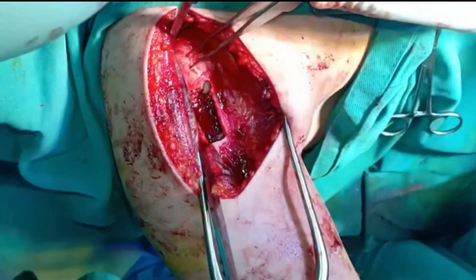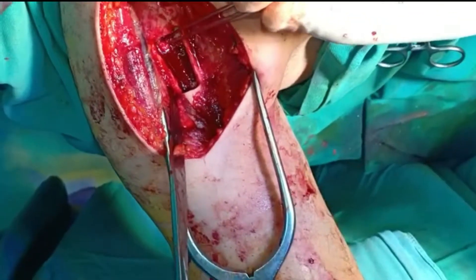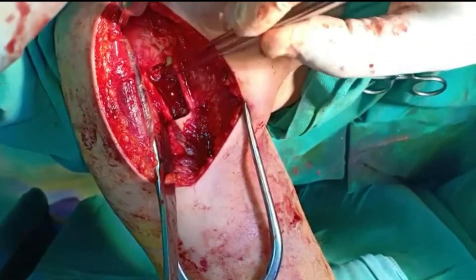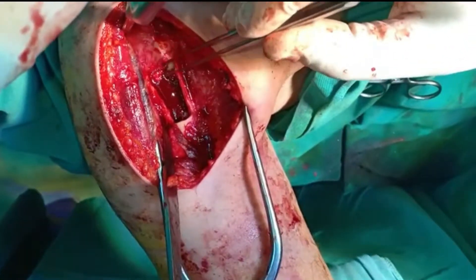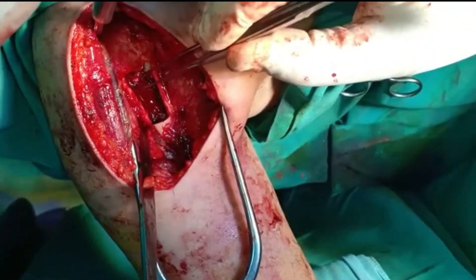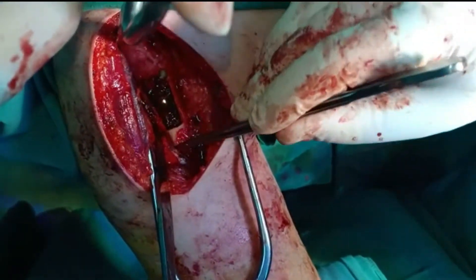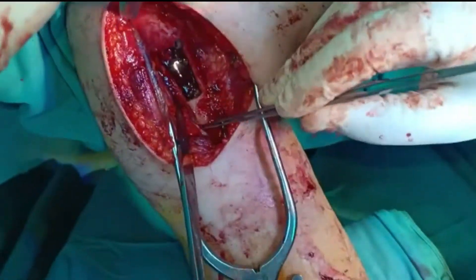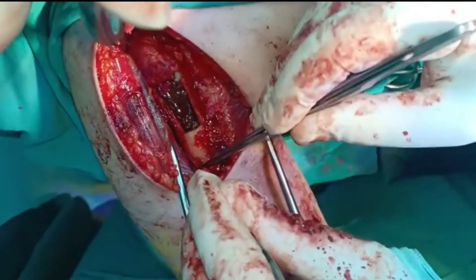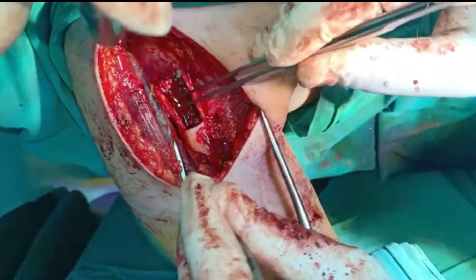We go to the bare area of the bone. We make a window, touch the tumor, and fill it with bone graft — cancellous bone graft. And because the defect is big, we are going to make a fixation with the Philos plate.